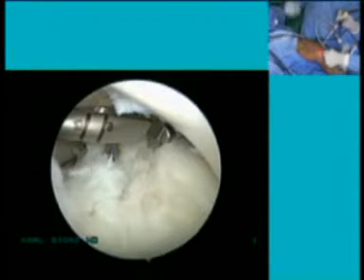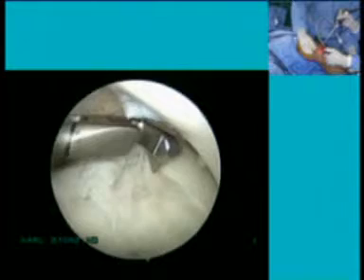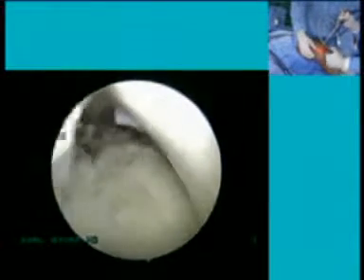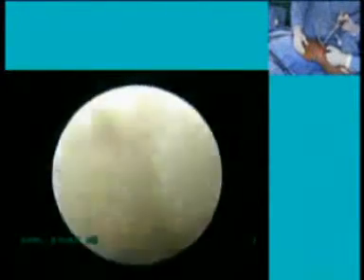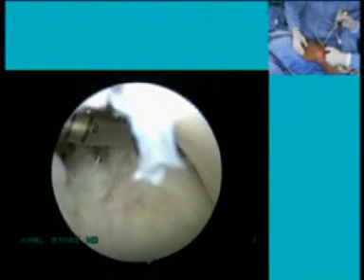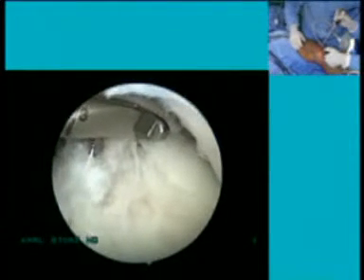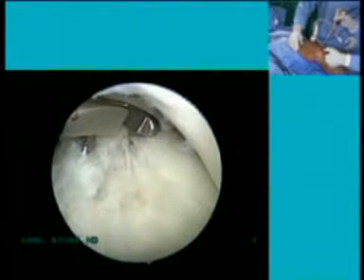Sundar, do you use a freehand technique drill for your double bundles? Freehand. Freehand for the tibial tunnel as well, Sundar? Yes, of course. Even if there's a convergence in the entry point, it doesn't make a huge difference. Now, what you want is a larger footprint. That is the ultimate aim when you do a double bundle.